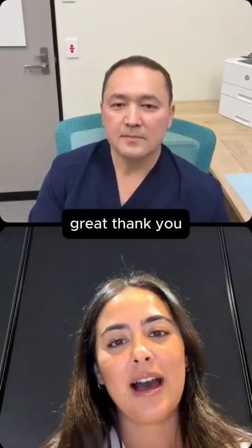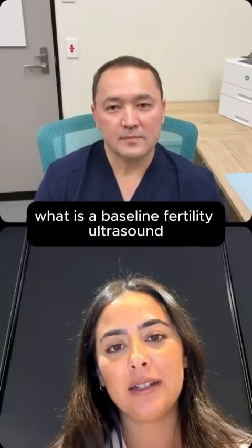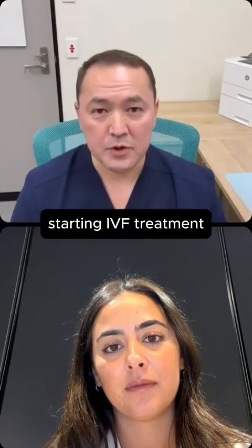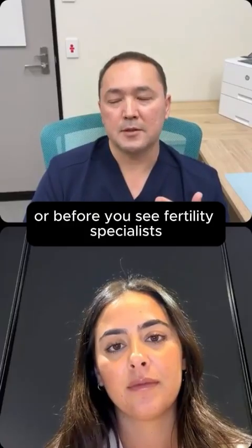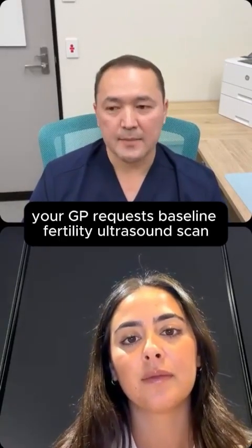Great, thank you. Could you please explain what is a baseline fertility ultrasound? Starting IVF treatment or before you see a fertility specialist, your GP requests a baseline fertility ultrasound scan.